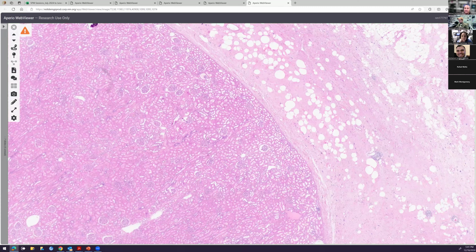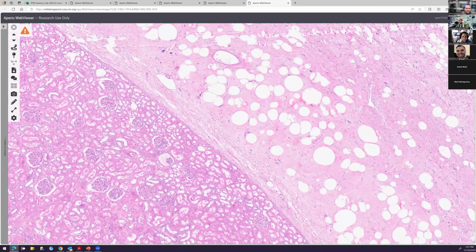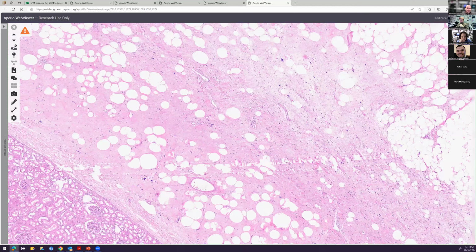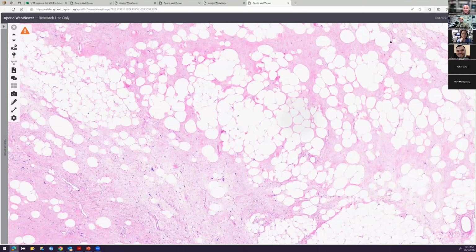Kidneys, right? Okay. So what are you going to call this one? What about over here? See this? Yeah, this one I'm going to call a well-differentiated liposarcoma. Exactly. So it's sarcoma, highlighting that, right? So this is again mostly mature adipocytes, right?